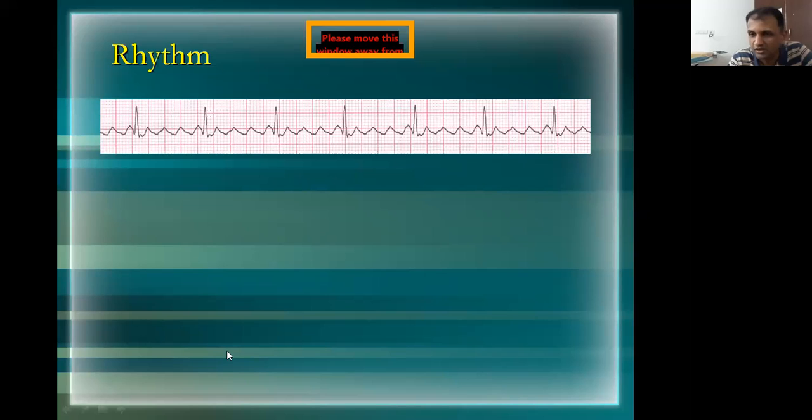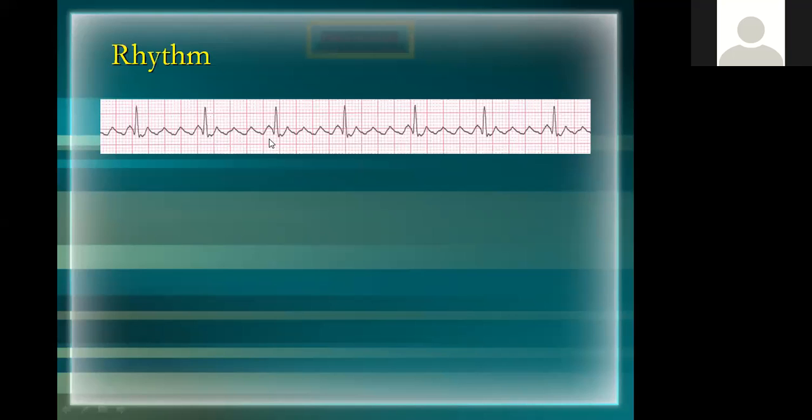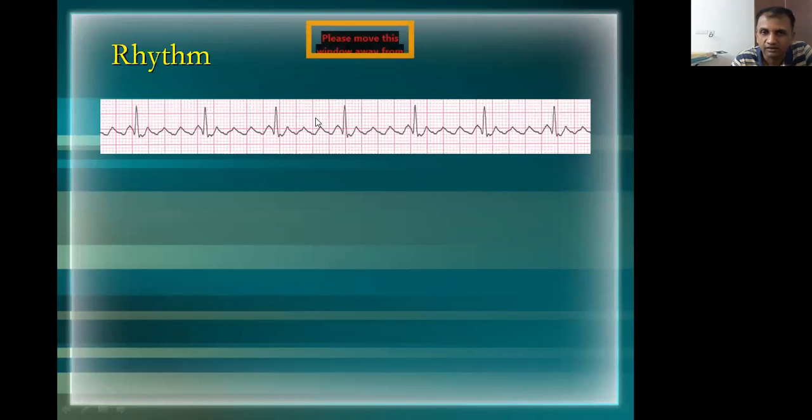Is it, Anushibia? Yes, sir. Okay, that's good. If you look at this ECG, you can see P wave, QRS complex, T wave, and you can see this sawtooth appearance. But the important thing is, if you look at this RR interval, between this R wave and this R wave, it's regular. In atrial flutter, you will have a regular RR interval. So you can feel the pulse, it's very fast. But the main striking feature is the sawtooth.